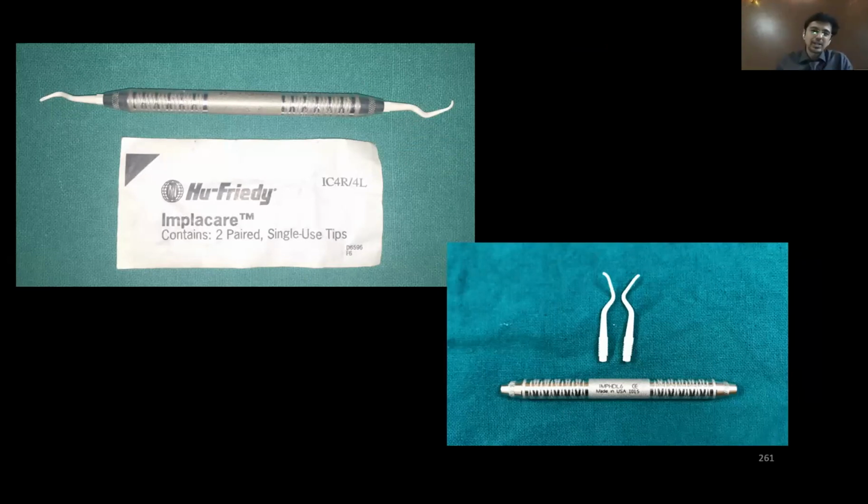So plastic curettage actually takes time. Be patient. Okay. But the point is always and always use plastic. Never ever should we use stainless steel with regard to implants as such.